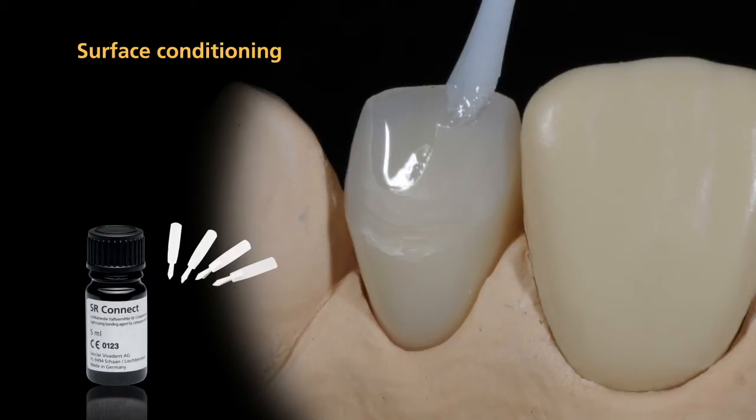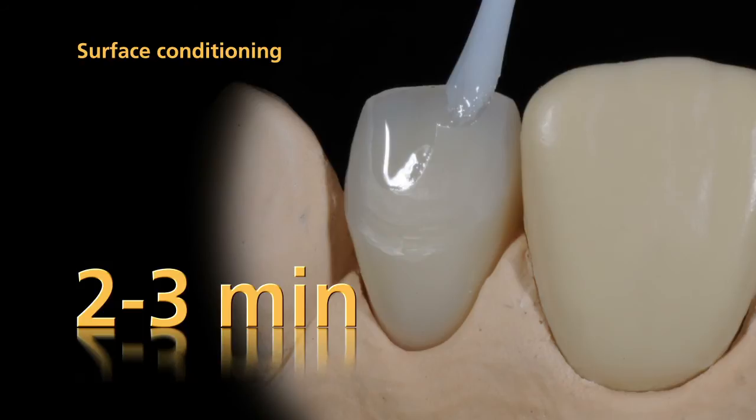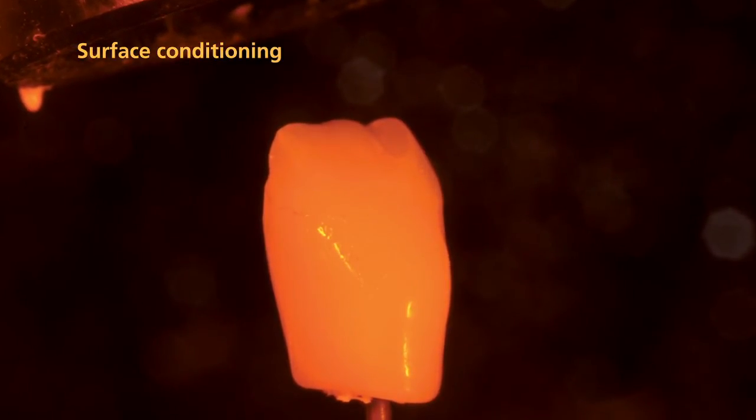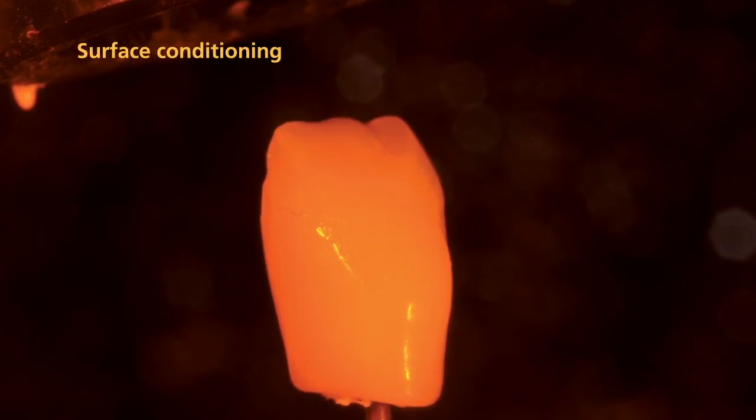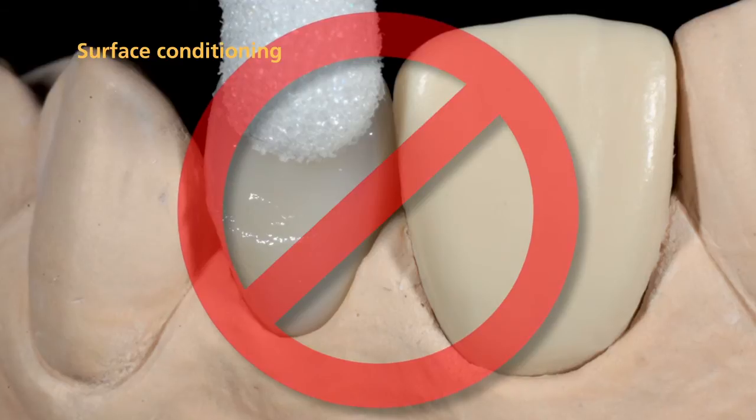Apply SR-Connect bonding agent in a thin coating to the prepared surface of the dentured tooth and allow it to react for 2 to 3 minutes. Subsequently, polymerize SR-Connect in a Lumamont light furnace using PROGRAM-2. Do not destroy the inhibition layer after polymerization.